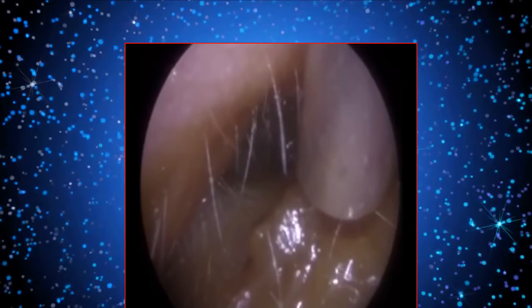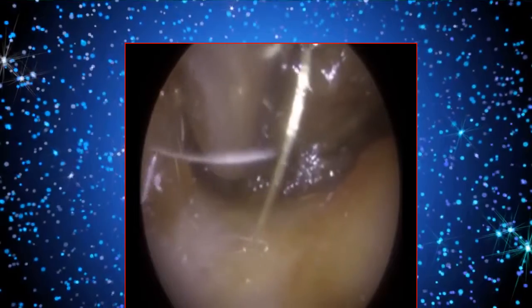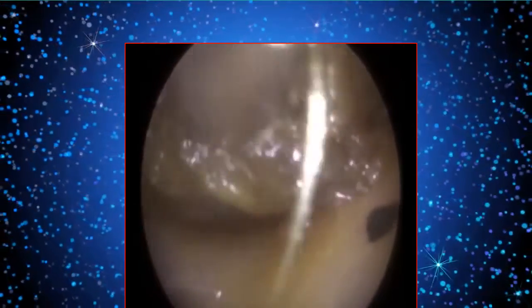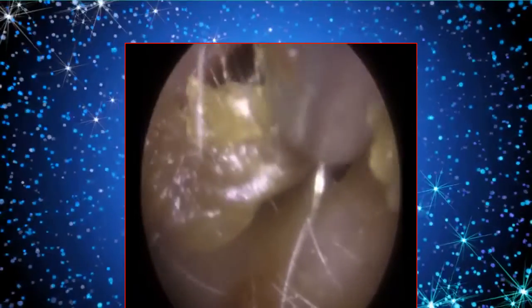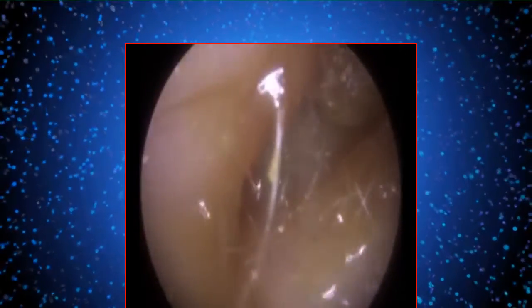Balance issues. In addition, as a clinical ear care specialist, I also specialise in the removal of earwax, infected debris and discharge from the ear canal. We have a client here who attended with bilateral, fully occluding earwax, and this ear at the moment is his left ear. You can see that the wax is quite wet and loose. The patient had been using some olive oil drops prior to attending.